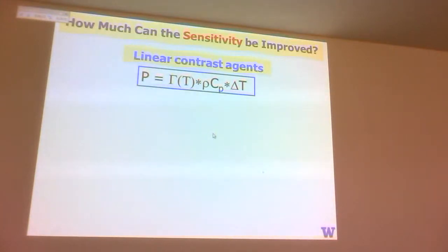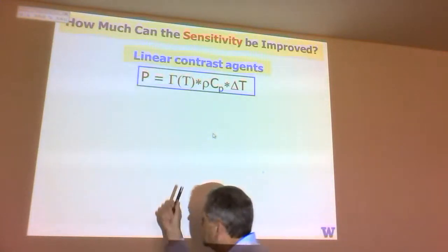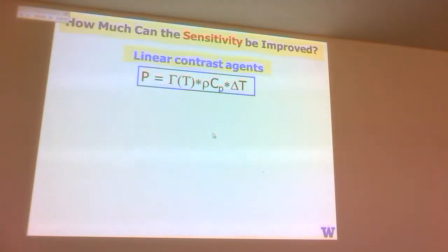Okay? And sensitivity has to do with the contrast agents we're currently using, which are linear contrast agents, because it's pure optical absorption that we're doing. So all the agents I just showed you, and all the agents developed over the last 15 years, are using linear, or what I would call linear, contrast agents, meaning that you try to increase the optical absorption in the area, but the sound is produced by the water around the particles, because it's the heat transfer.